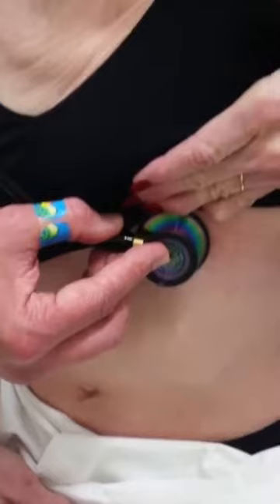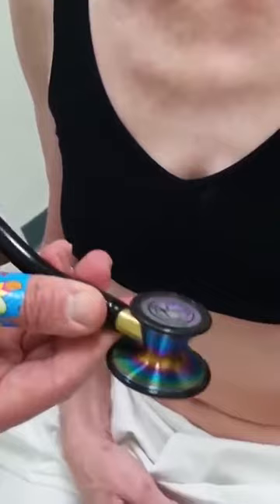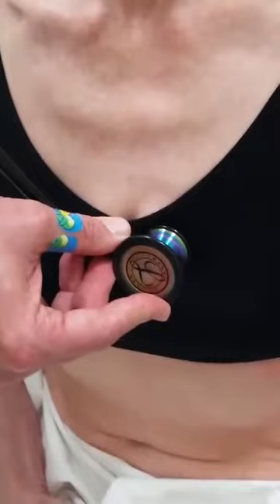Once you've assessed here, you then take your stethoscope and flip it over so that you have activated your bell. We will then go back to the tricuspid listening post, asking the patient to lift her breast, going down to the fifth intercostal space in the mid-clavicular line for the bell auscultation of the mitral valve post.